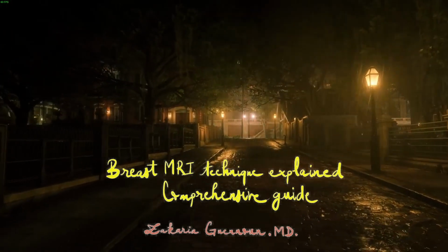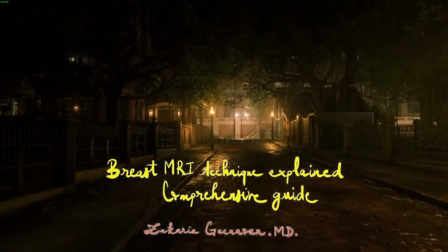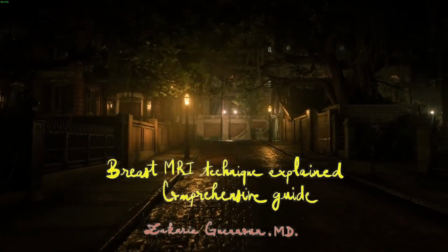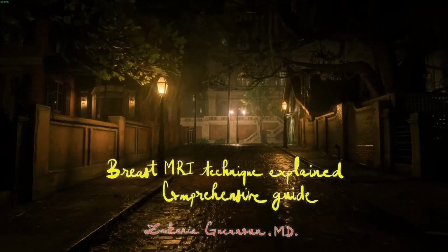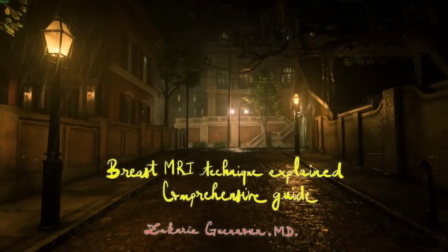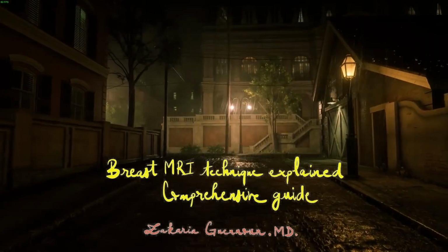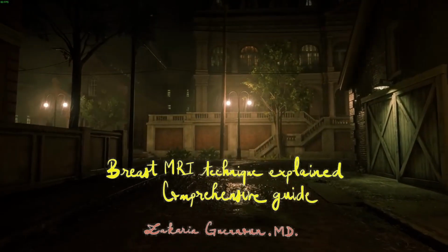In fact, there is some balance to be made during breast MRI between spatial resolution and temporal resolution. Spatial resolution will be obtained with thin slices, and it's great to analyze the morphology of the lesion. Temporal resolution, on the other hand, will be obtained by performing multiple post-contrast scans, and it's great to analyze the kinetics of the lesion. So if you do multiple post-contrast scans, you won't be able to do high-resolution images, so you will lose some spatial resolution.